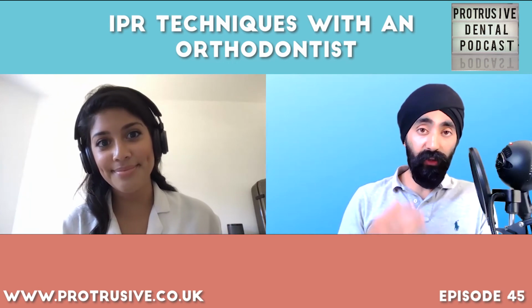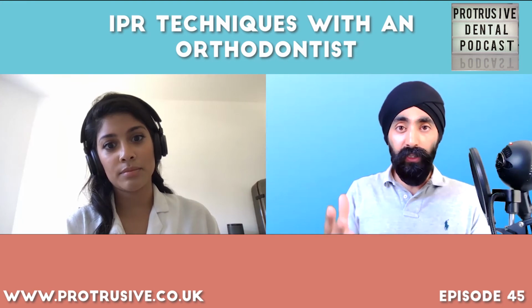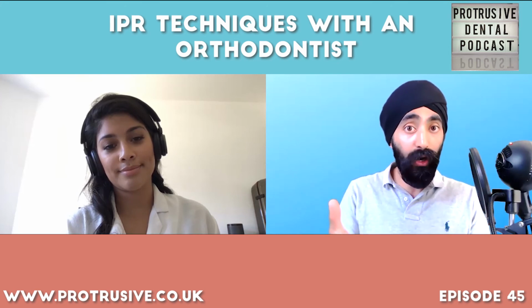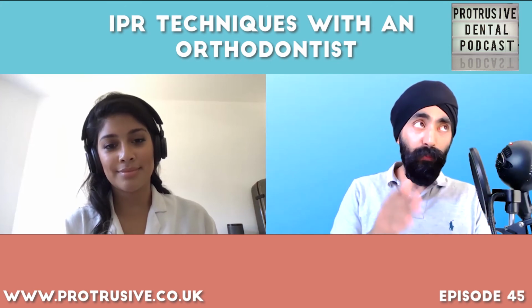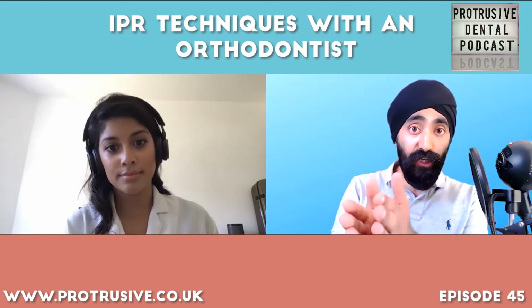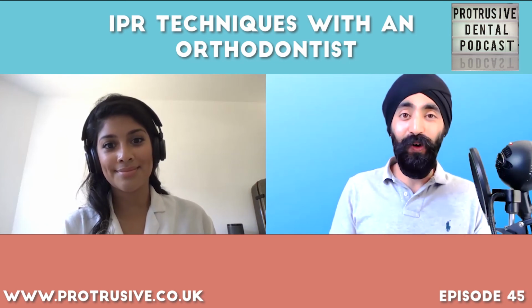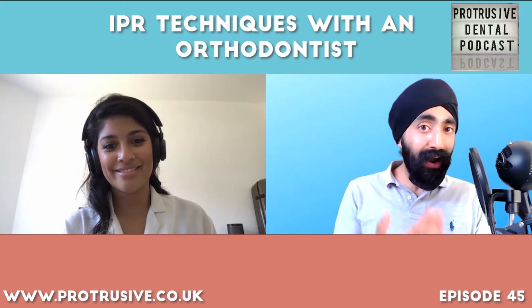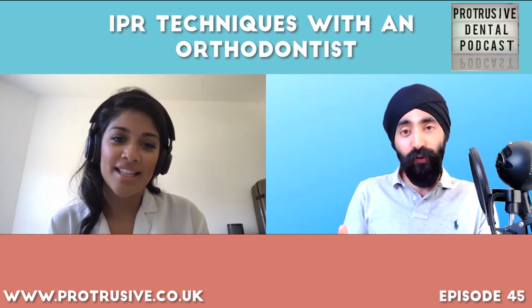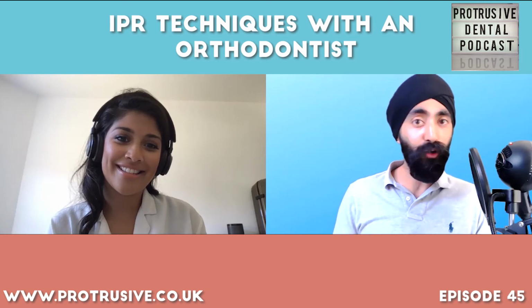Brilliant. I love that. And one thing you just reminded me of is you mentioned earlier about whether you're doing fixed appliance or Invisalign, the movements and the stages of the movements are very similar, if not identical. So in fixed appliance, you're waiting for the contacts to become parallel, uncrowded, and then you're doing the IPR. Whereas when I've been on the Invisalign courses before, they're very scared about round tripping. Can you explain why are Invisalign folk scared of round tripping, where actually in fixed appliance we are round tripping a lot?